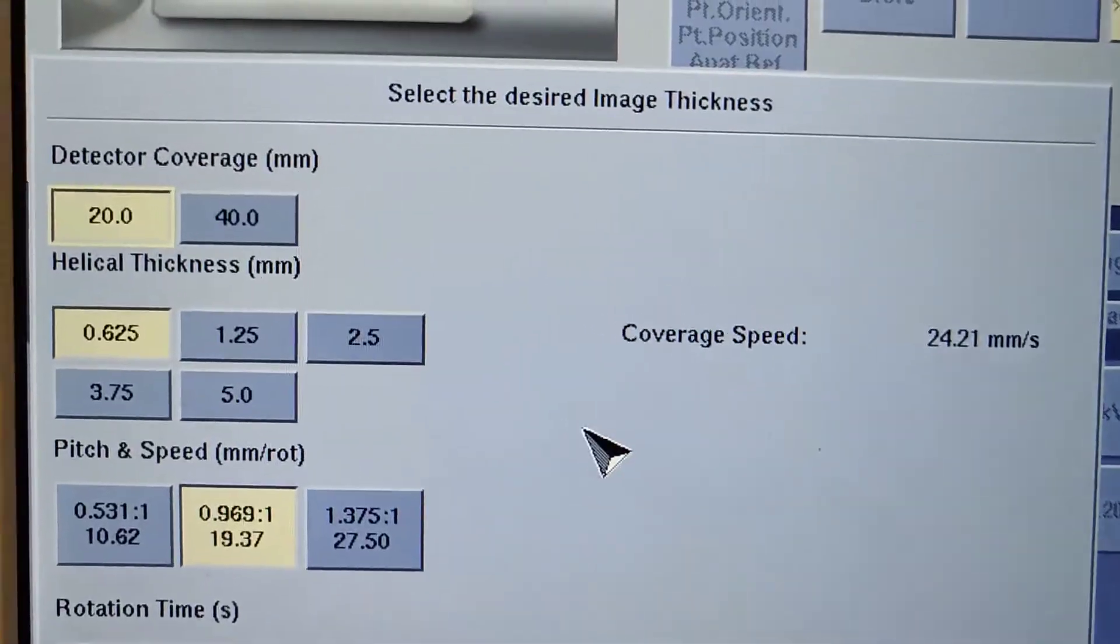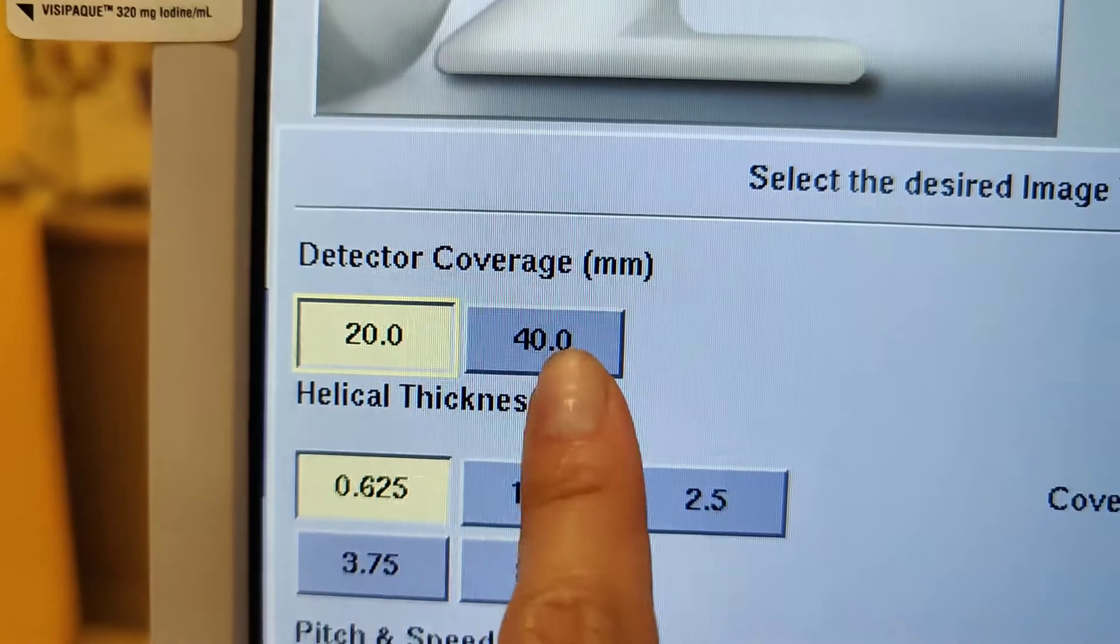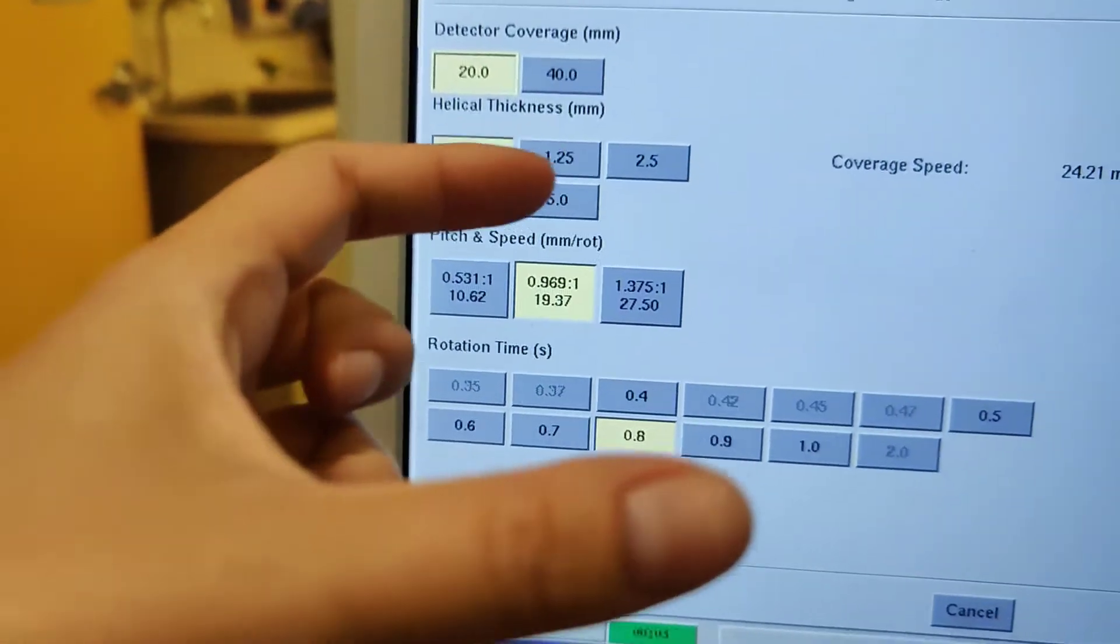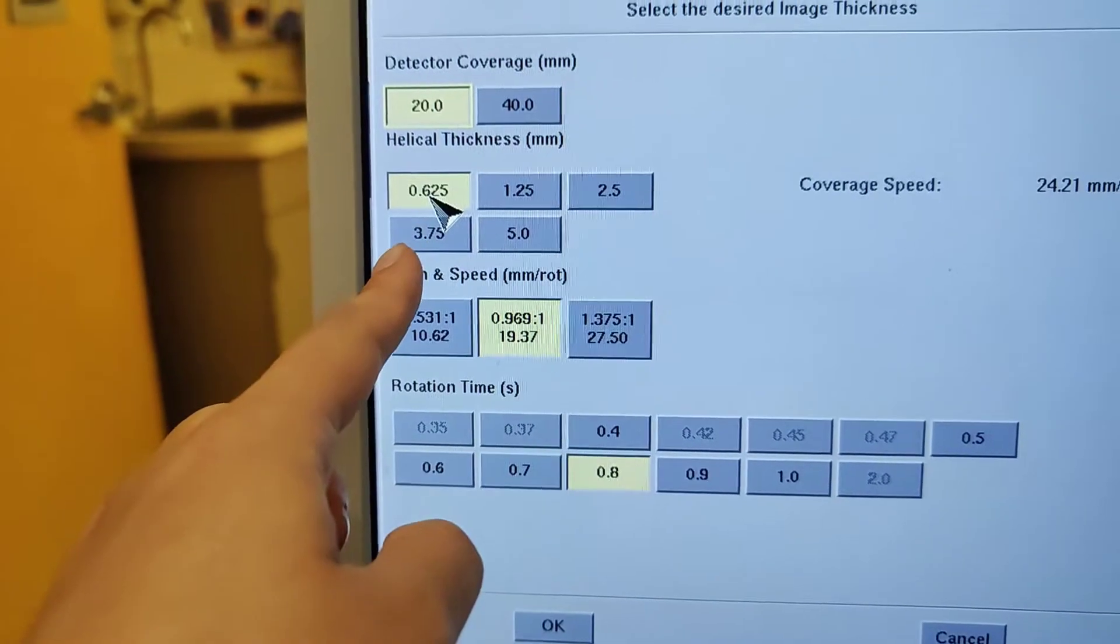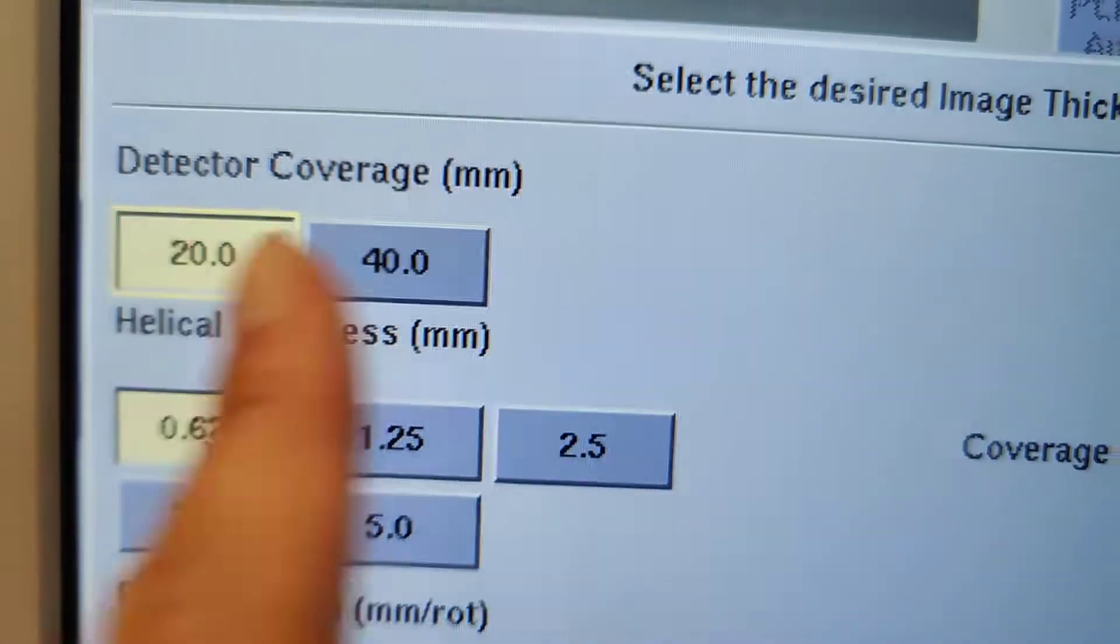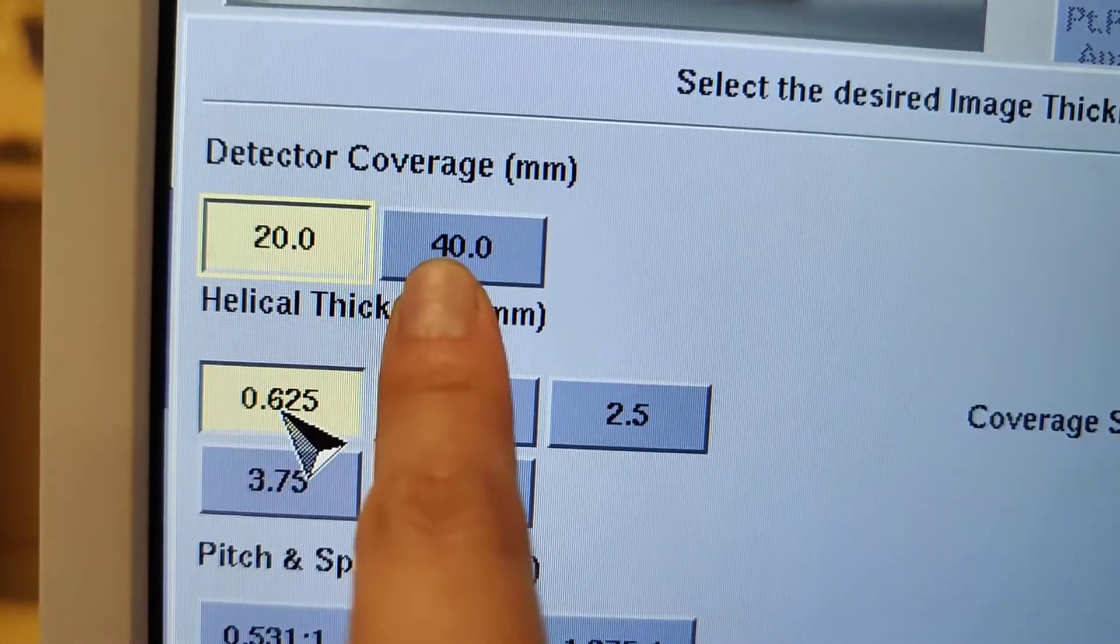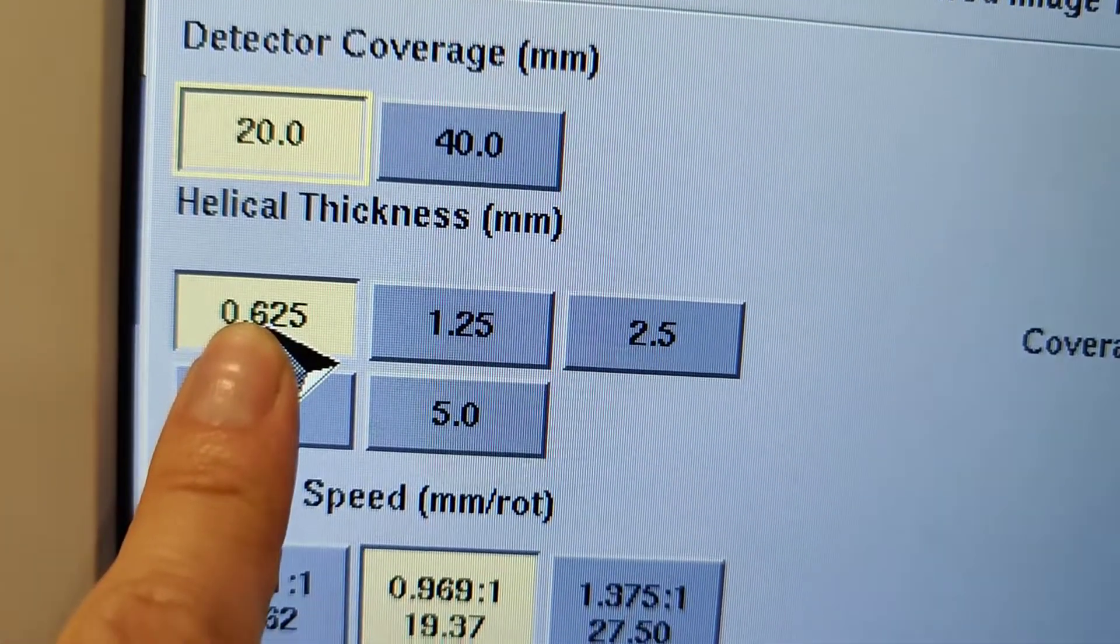And then right here is the coverage for the detector. So how much scan you're going to get with one rotation. So this is the most detector coverage that you'll get. So this is the smallest and thinnest slice.